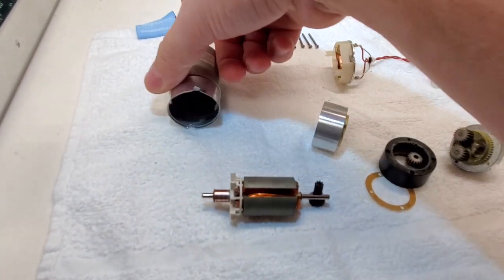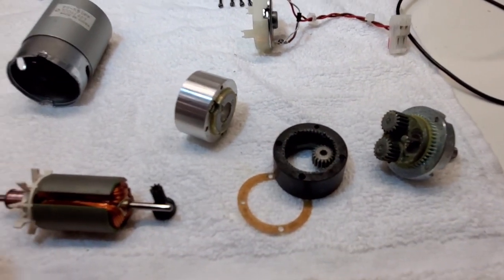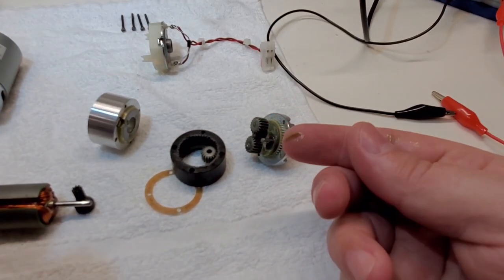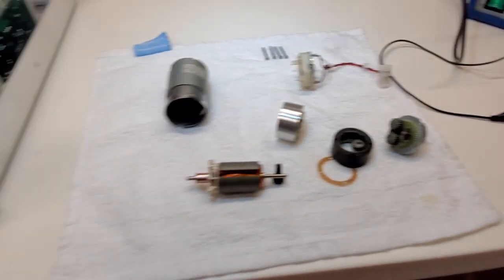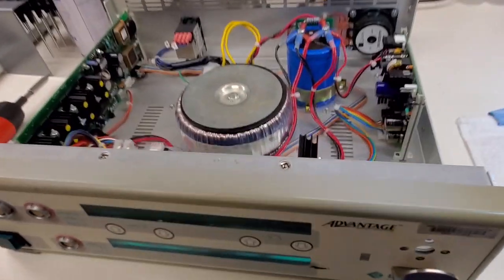I just tore into it because why the hell not? Just cool to take a look at it so you guys can see what would fail. And this grease right here is probably part of the problem. It's very sticky. It got thicker with age. And that's to be expected. This is a 16-year-old unit. We bought it in 2004.